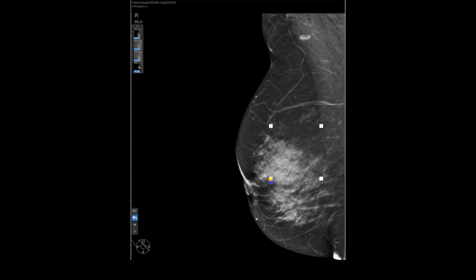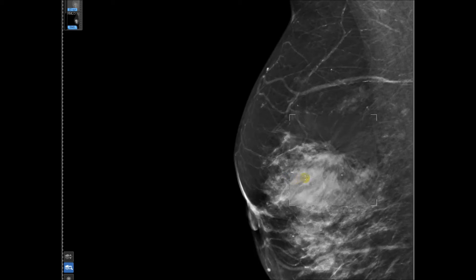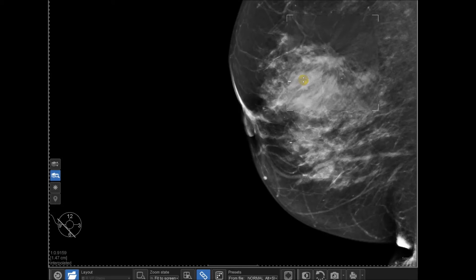It also has what we call the volume preview inspector. It basically brings up a magnifying glass wherever you click the mouse, and within that magnifying glass, by moving the scroll wheel or the mouse, you can scroll through the 3D data set. It even has a little position marker that tells you where you are in the volume.